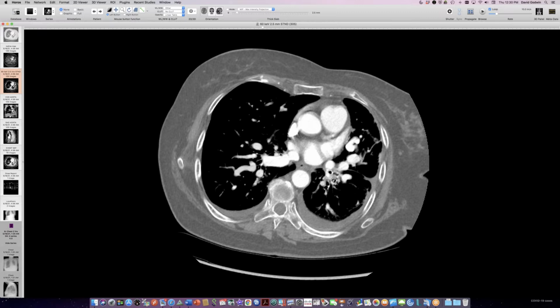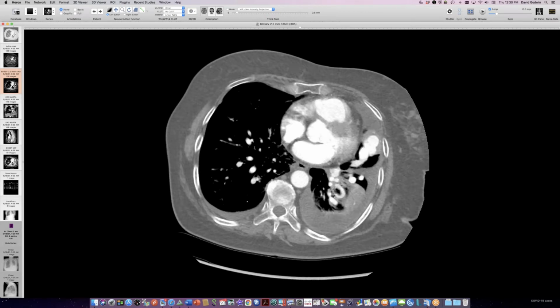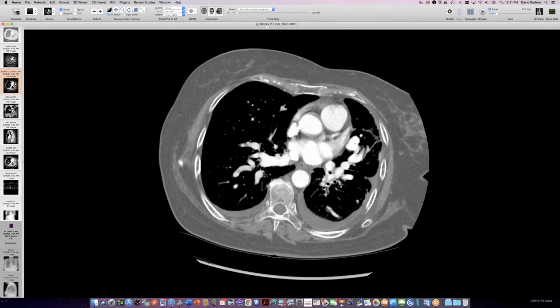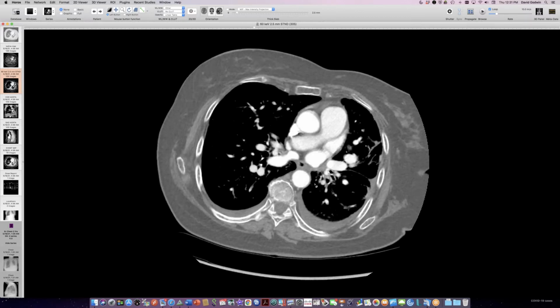So granulomatous fibrosing mediastinitis, this is really a Midwestern disease. In her case, it's a Central American disease, and attributable to histo, although I don't think we've pinned it down with any bacteriology or anything like that, or serologies in her case. And then this varicoid alteration in her inferior pulmonary vein on the left. So GFM strikes again. Somebody showed a case last week or the week before. And then this one just came up fresh this week, but I'd seen it more than 10 years ago, and I've now added the new imaging to it. I think with the venous problem, she also has some pulmonary hypertension.